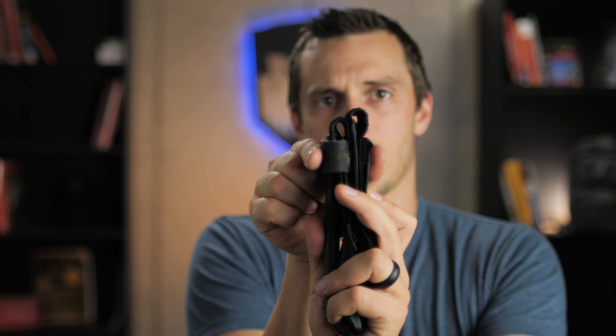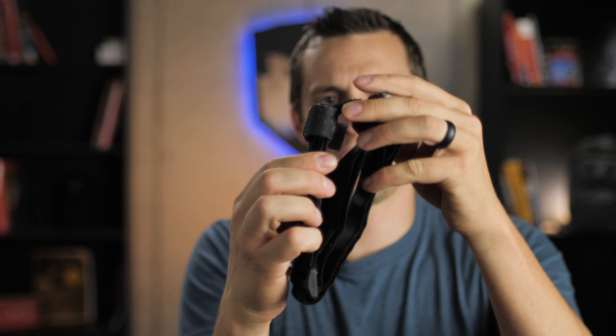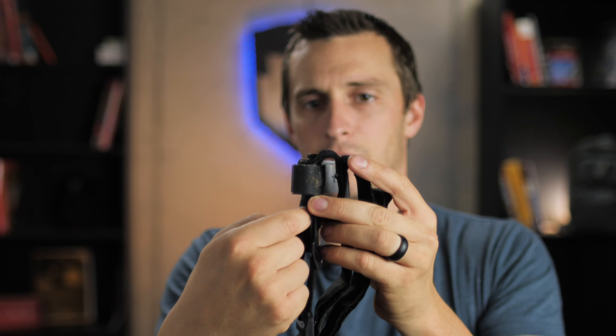If you look at the tourniquet and the way that it's set up, you have this large plastic clip in the front — that's the majority of the bulk of this tourniquet. But then you have all this extra strap that is in the back, and that becomes the widest part of your tourniquet. What if we take all this in the back and fold it up in the front so it fits underneath this clip? That's what we're going to show you how to do.